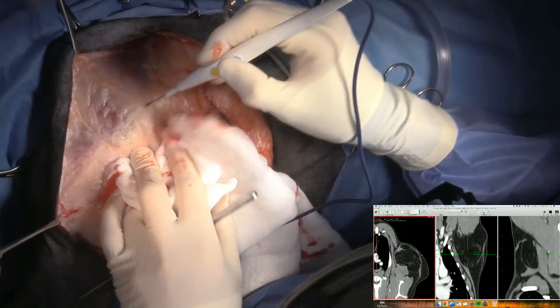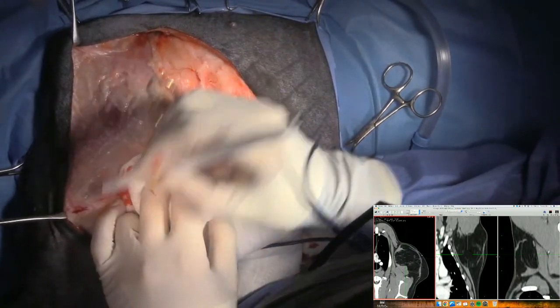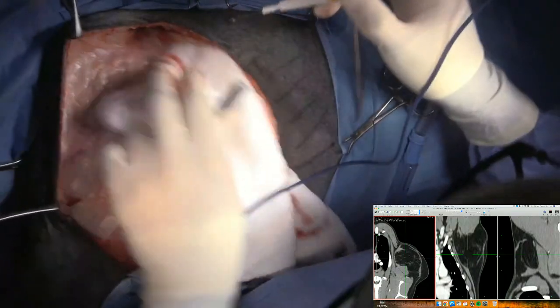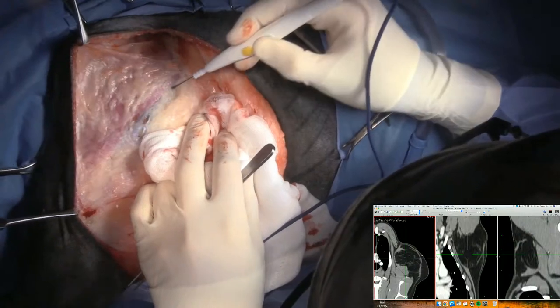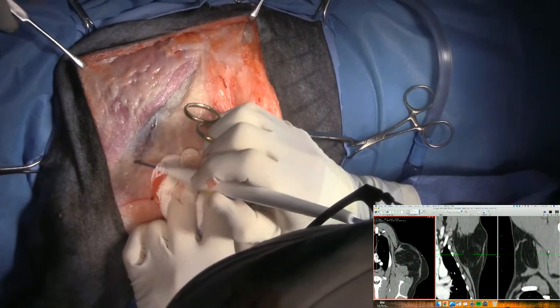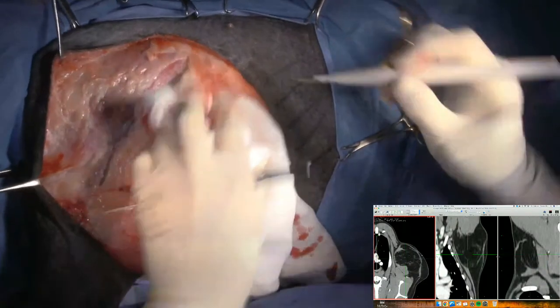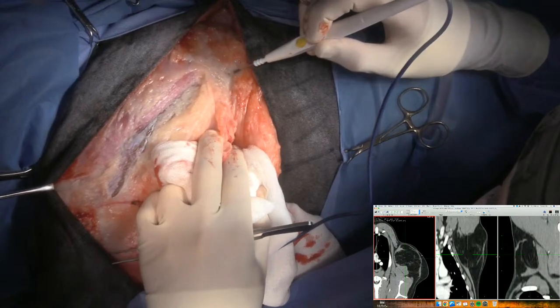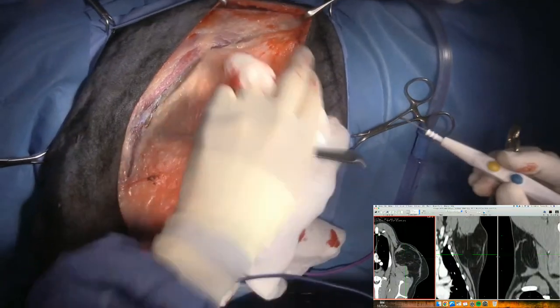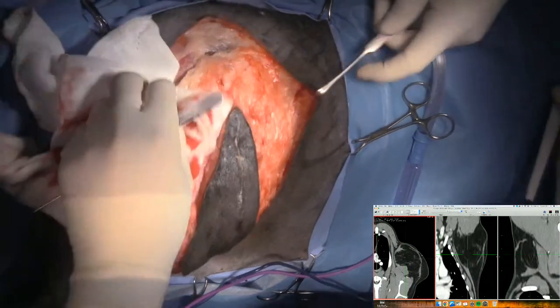So I'm right along the spine of the scapula here, and I can still see fat that looks abnormal. It's hard to tell in a chubby dog what's abnormal fat and what's normal. But with infiltrative lipomas, once you find out which muscle is involved, often you can just peel them out other than the muscle itself. So we'll just leave that for a minute, Piyush.